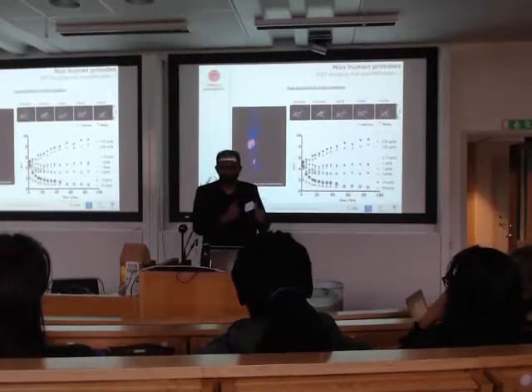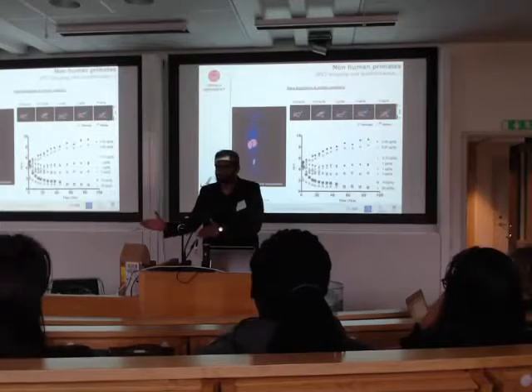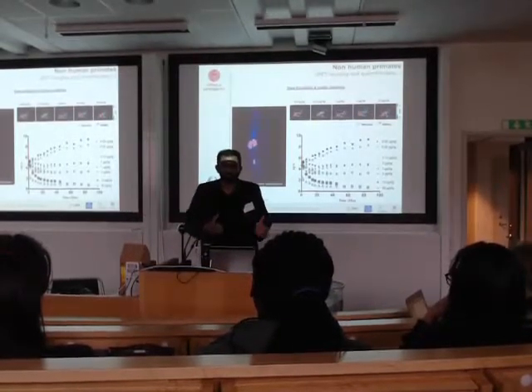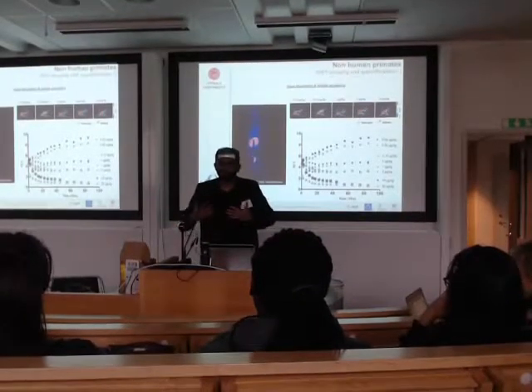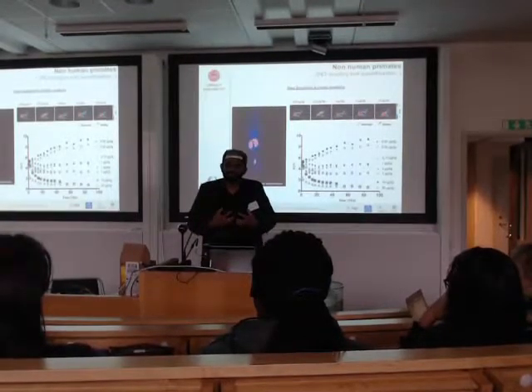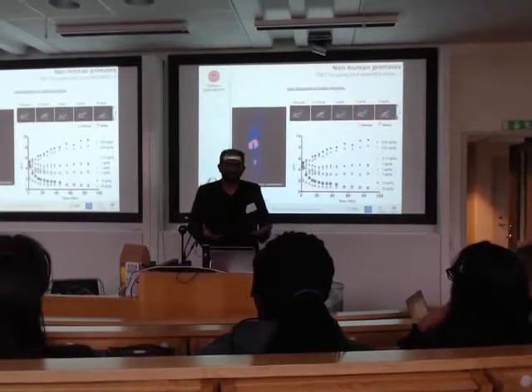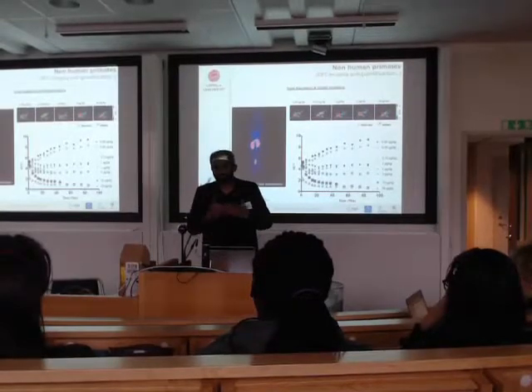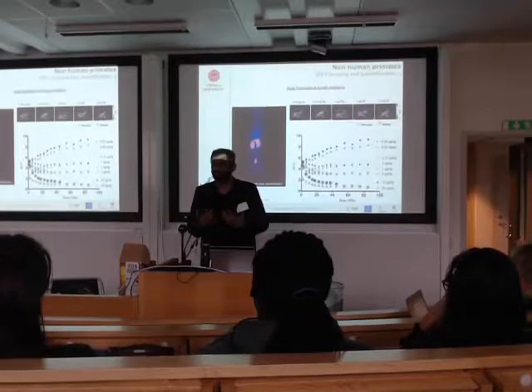There, we did the same dose escalation study. We had 100 units of tracer, then 100 plus extra units of unlabeled peptide. With the increase of cold peptide dose, we were able to block the uptake in the pancreas. This was good enough. It shows that the tracer is binding to the pancreas, but we couldn't confirm whether the binding is indeed just in the islets or somewhere else in the pancreas. Even now, it's really hard to get ethical permission to make a monkey diabetic.